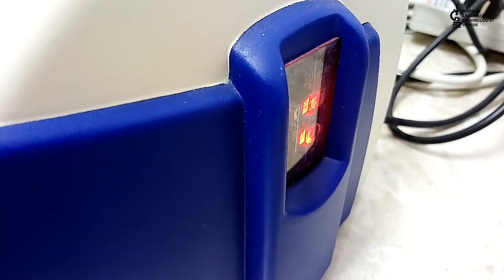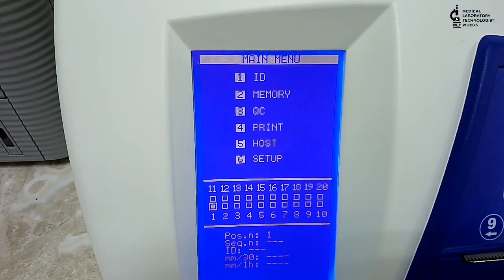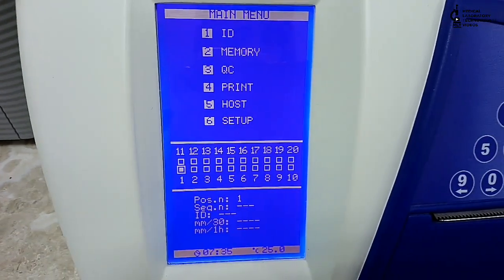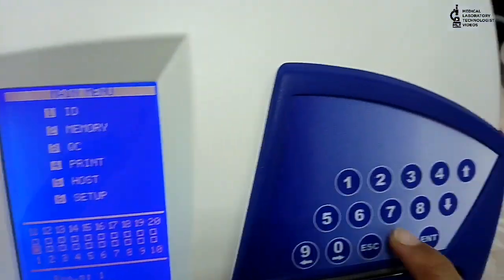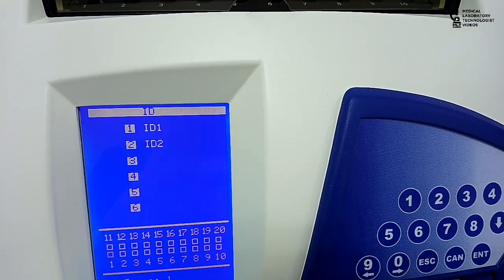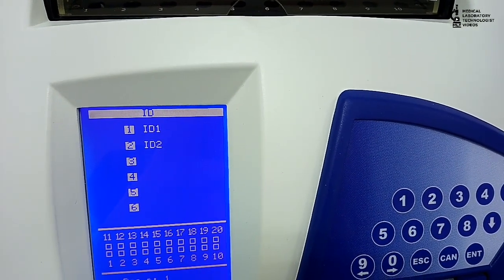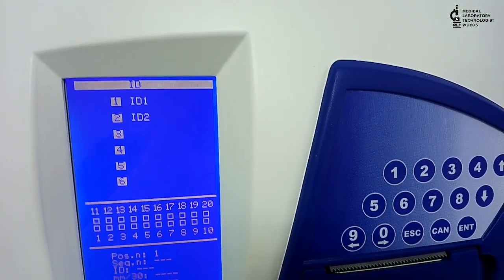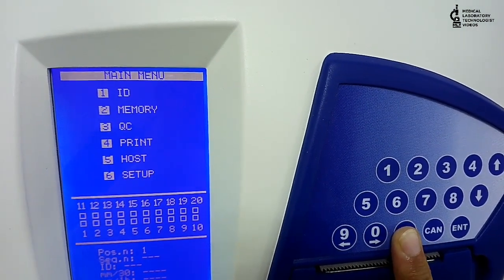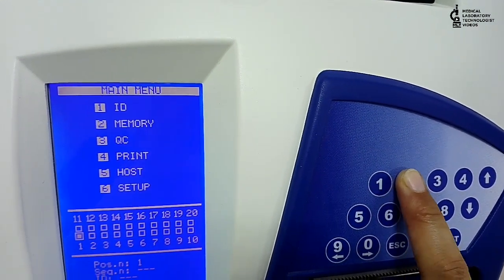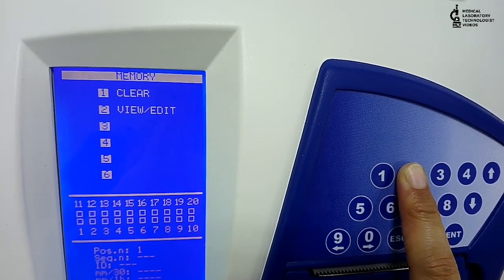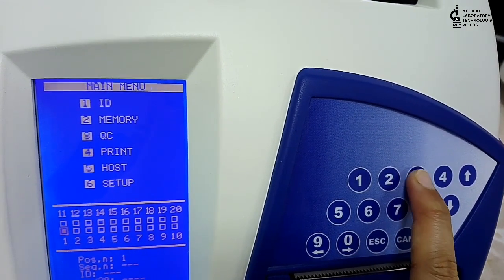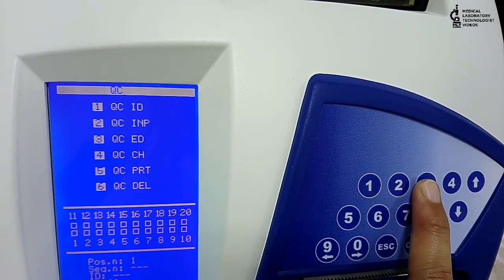This is the main screen. As you can see, first is ID, and in that ID1 and ID2. ID1 means you can enter sample one by one, and ID2 means you can run a batch. Now I will go Escape and right click button 2 that is for memory. From there you can view results. 3 is to run QC.